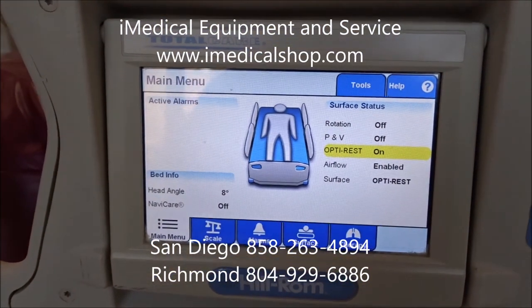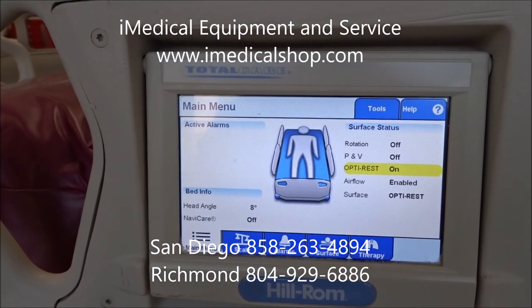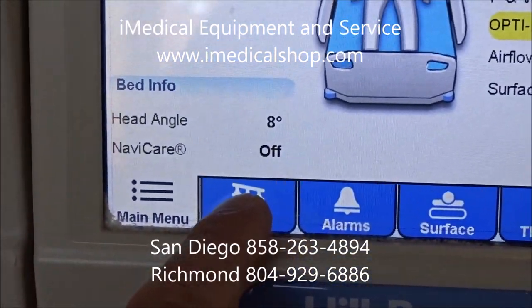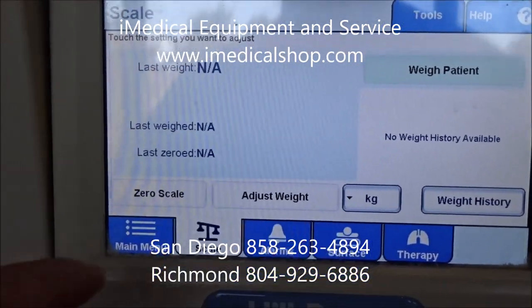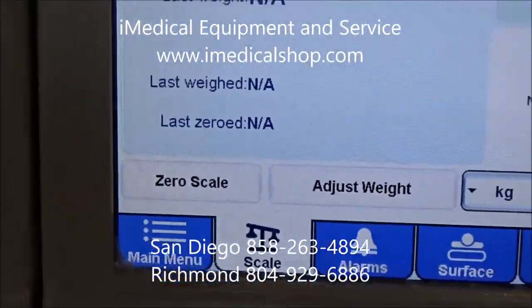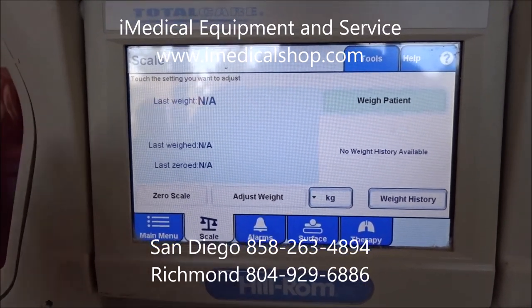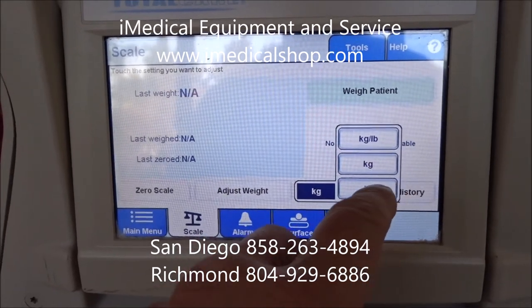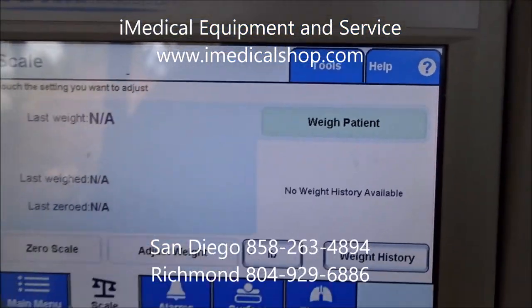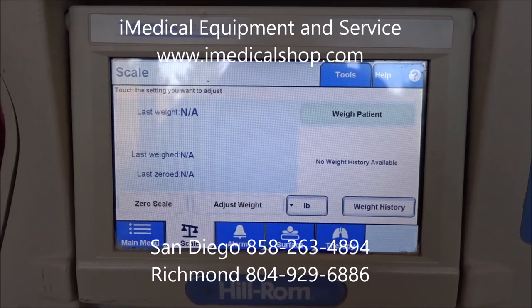A very important feature is that the mattress system works based on the weight of the patient. The first thing you must do when you get this bed is use the scale. Hit zero to zero it out, then weigh the patient. You can adjust the weight and select pounds instead of kilograms. Once zeroed out, hit weigh patient. Please do this first — it's very important that the mattress firmness is adjusted based on the patient's weight.